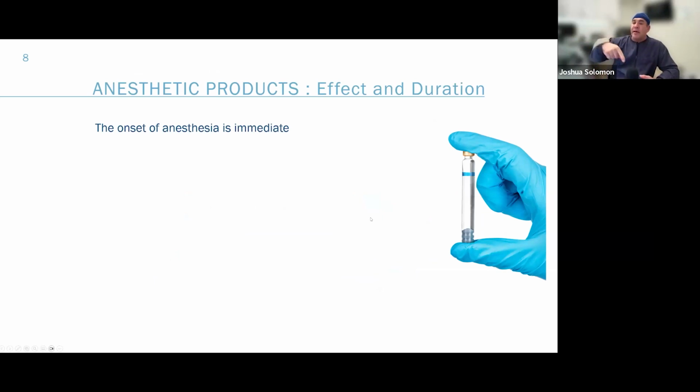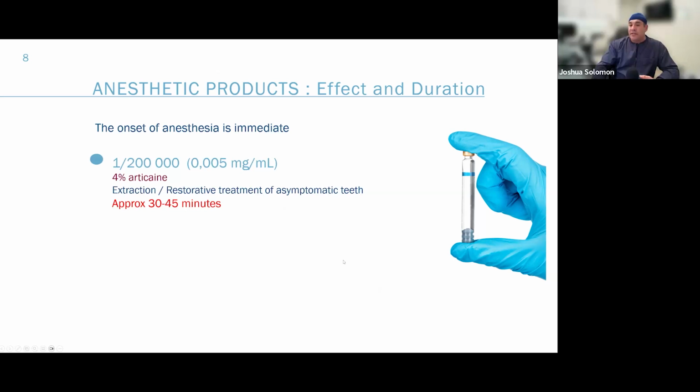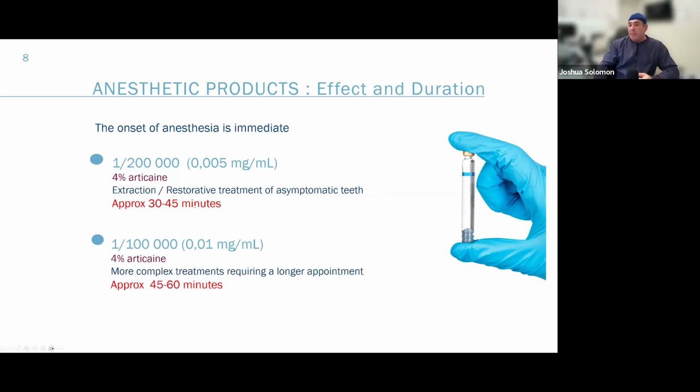But remember, there is a radio wave that's got to get from your pedal to the unit itself. Again, I just want to make this point about working times. I don't want everyone to forget this. At 1 to 200,000, you've got about a half an hour to 40 minutes or so. With 1 to 100,000, that goes up pretty much to an hour.